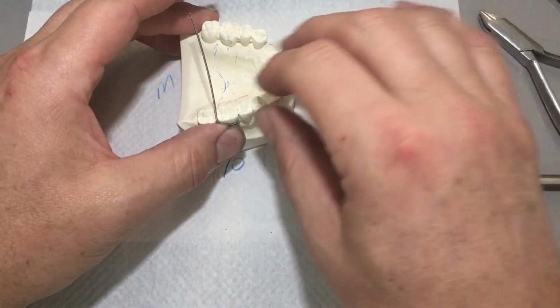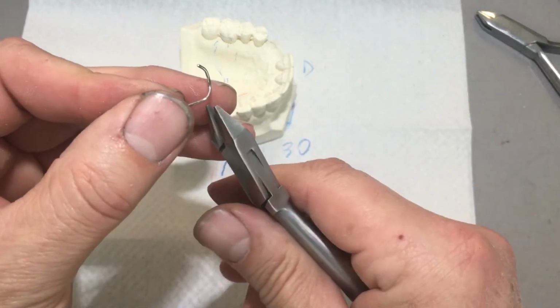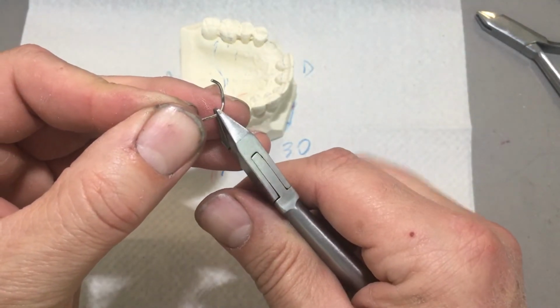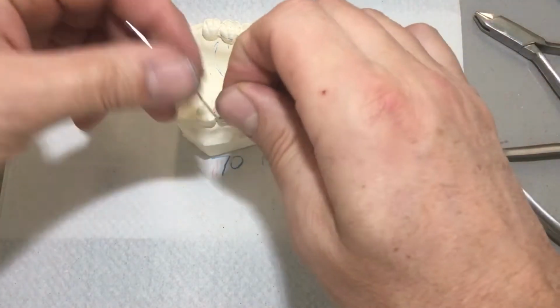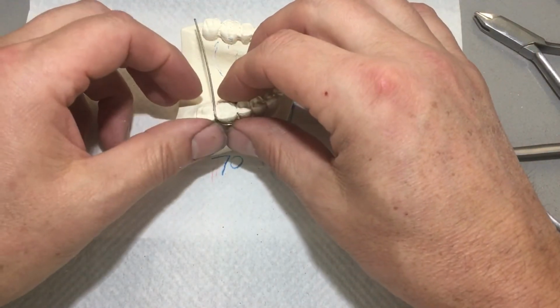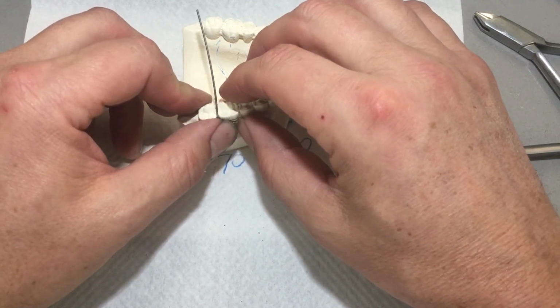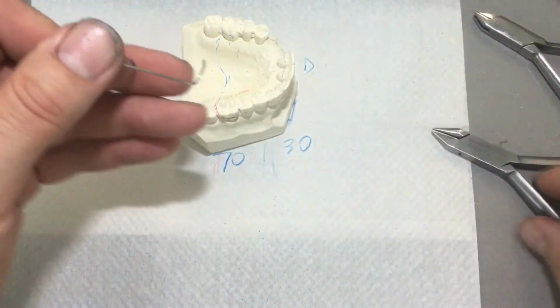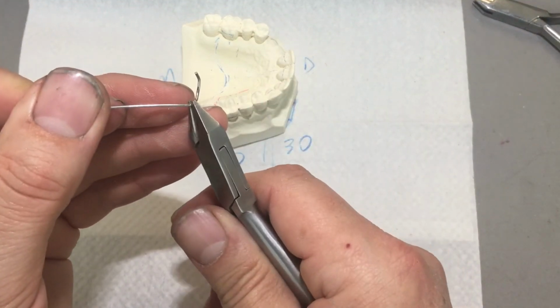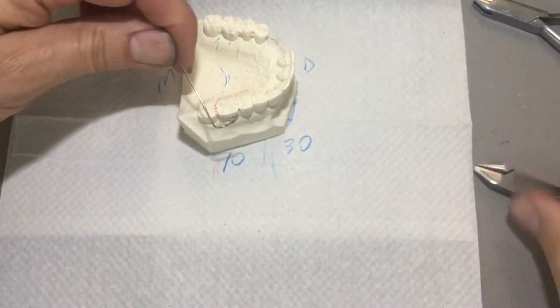There is some leeway in perfection, but still, it's got to draw, meaning it's got to fit, number one. It's got to be aesthetically pleasing, number two, for these two teeth. It's got to function for what it's meant to be functioning for, if it's aesthetics and or mastication. And this is where I think most of us are going to have trouble, is crossing the occlusion.